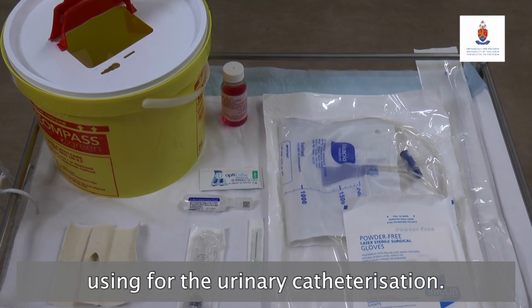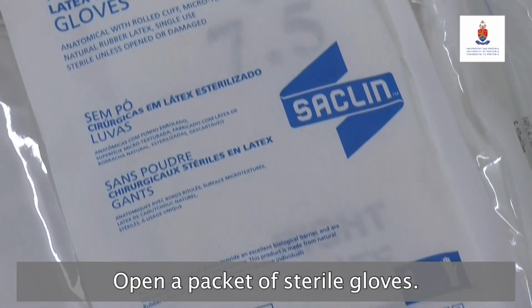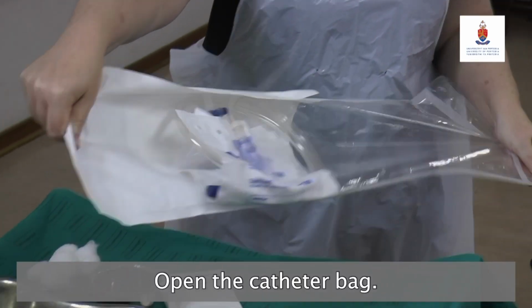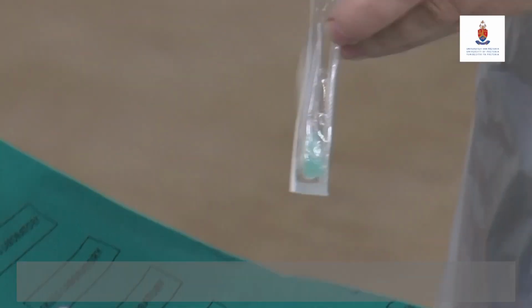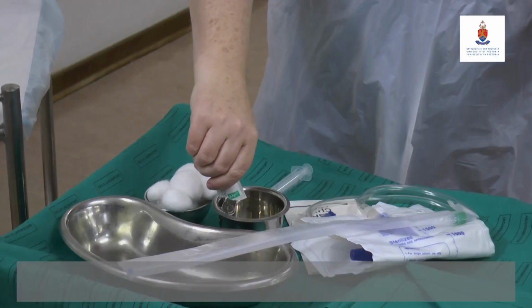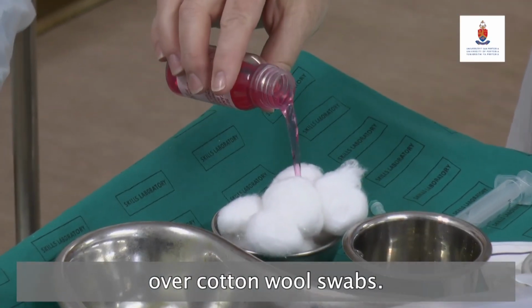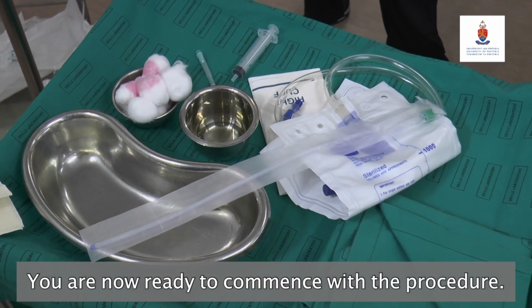Prepare the tray that you will be using for the urinary catheterization. Open a packet of sterile gloves. Open the catheter bag, as well as the needle and syringe. Add KY jelly to a bowl. Pour a few milliliters of a hibitane in water solution over cotton wool swabs. You are now ready to commence with the procedure.